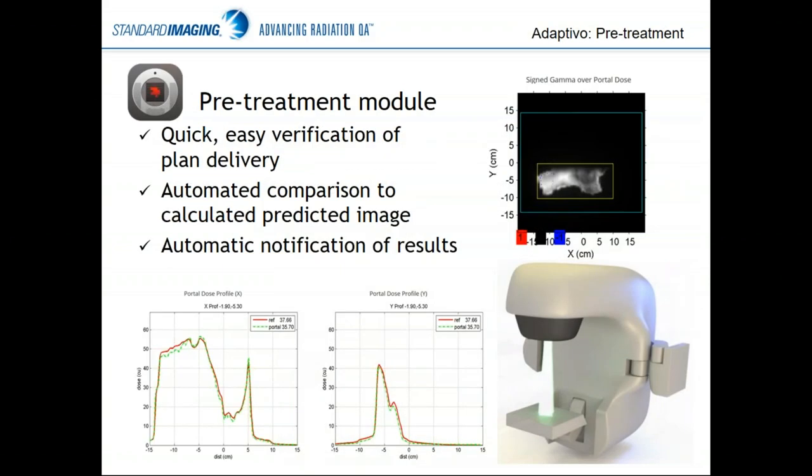The pre-treatment module is a quick and easy verification that you can deliver the plan as intended. It is a through-air delivery to the portal imager — no couch, no phantom, no patient in the way. We predict what that image is going to look like from both a dose magnitude standpoint and in 2D. It is a composite 2D image for each beam. We compare the measured image to the predicted image and notify you, depending on your settings, whether or not the beam has passed or if pre-treatment QA has been delivered.